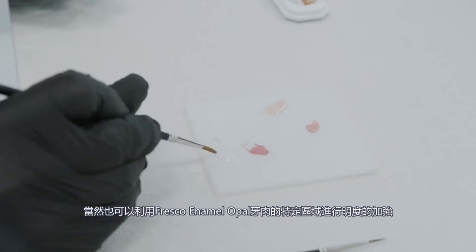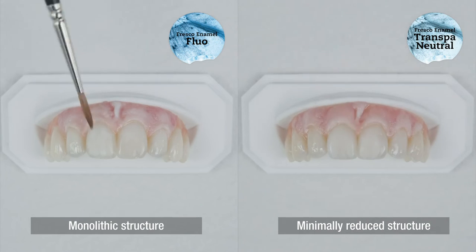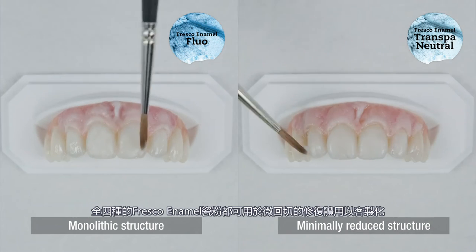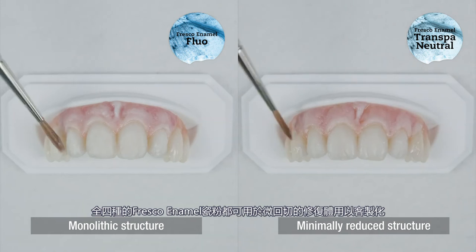For natural fluorescence, you can further veneer the monolithic structure with Fresco Enamel Fluo. All four Fresco Enamel pastes can be applied to the minimally reduced structure in a patient-oriented design.